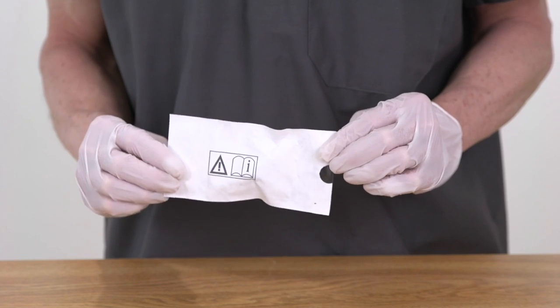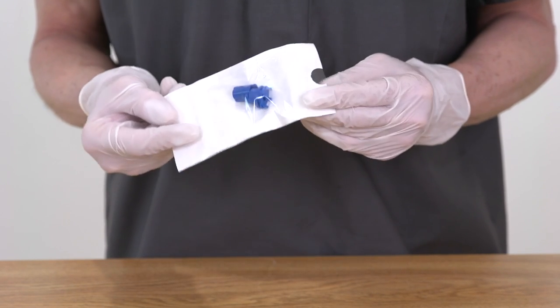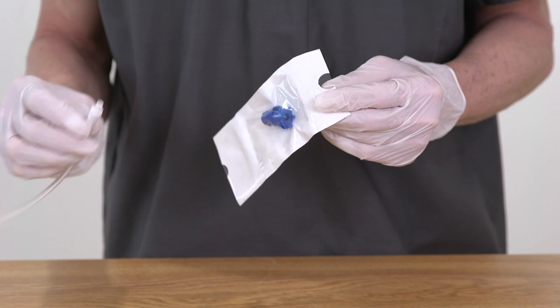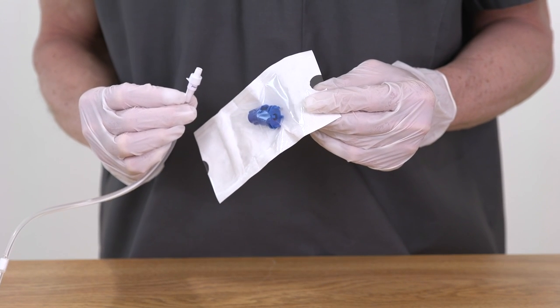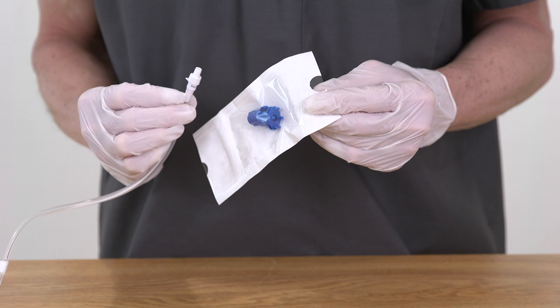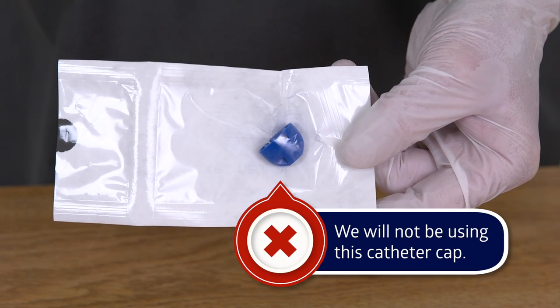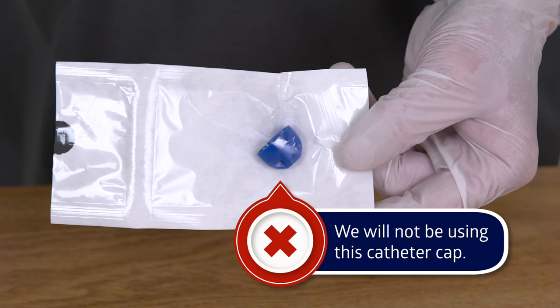The other packet has a small catheter cap and an adapter that allows the ROCKET IPC Pleural Drainage System to be used if the patient's catheter looks like this. We will be showing how to use this catheter cap and adapter. Aside from the adapter, all other steps are the same for both catheter types.